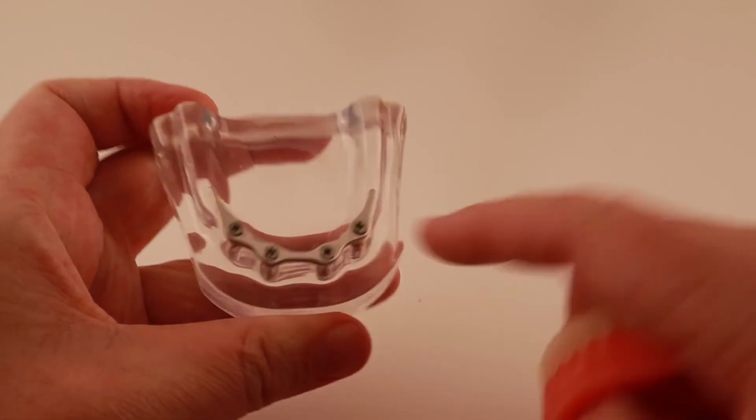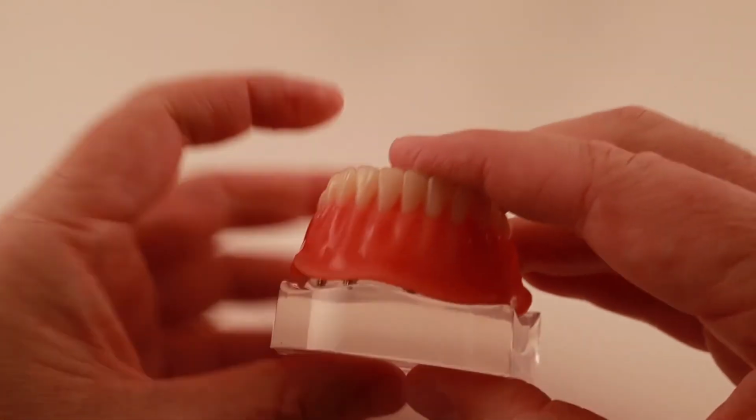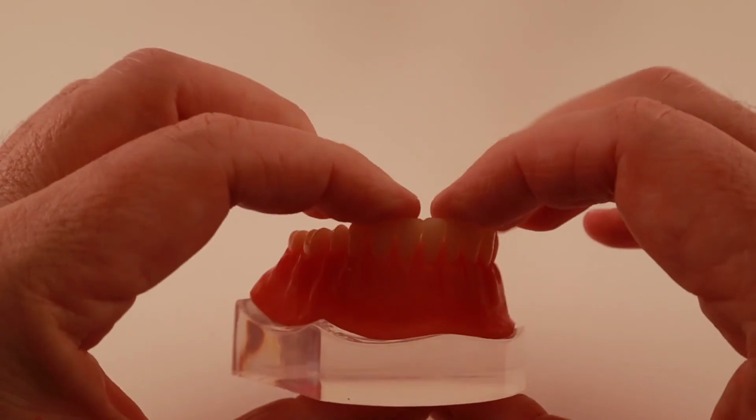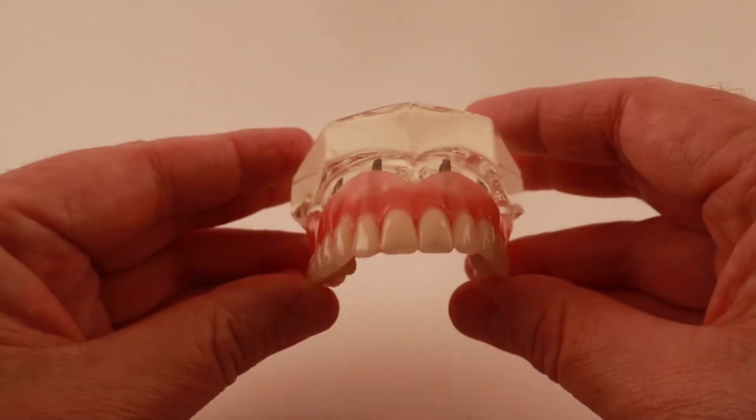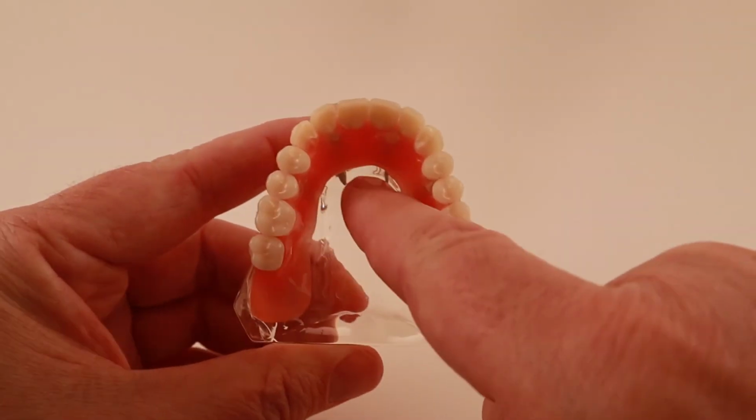Once the metal bar is in place on your implants and the overdenture is clipped onto the bar, very little pressure is transferred to your gums. The implants are taking all the biting and chewing force. The nice thing about either type of overdenture is that I can make you an upper overdenture that doesn't cover the roof of your mouth, so you'll be able to taste your food better.